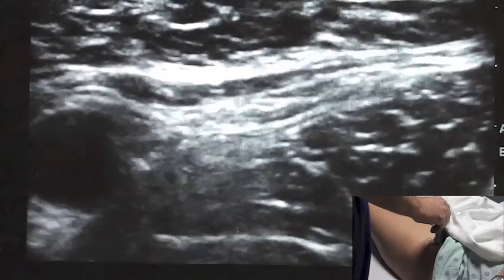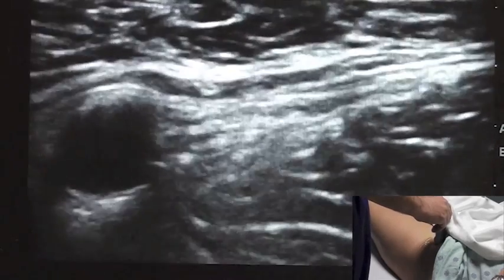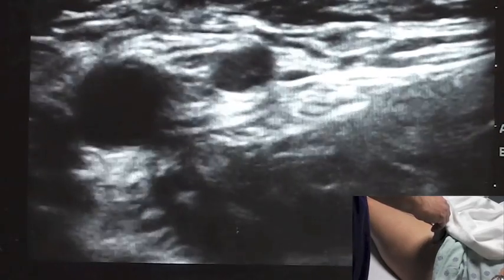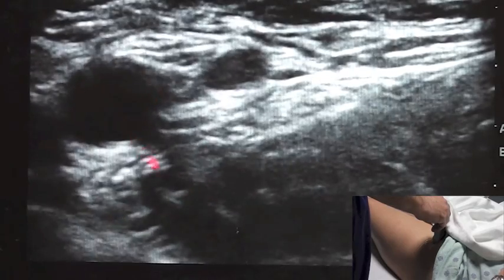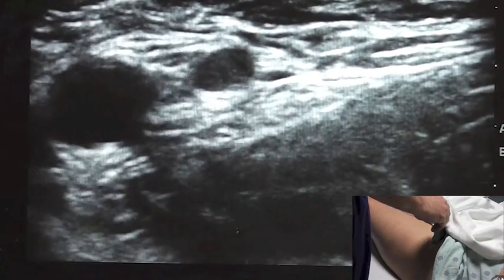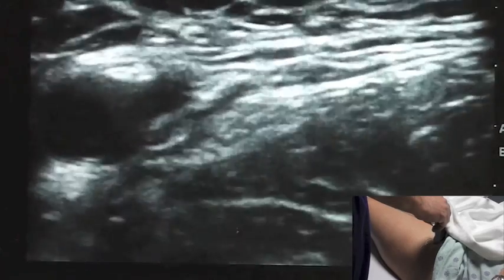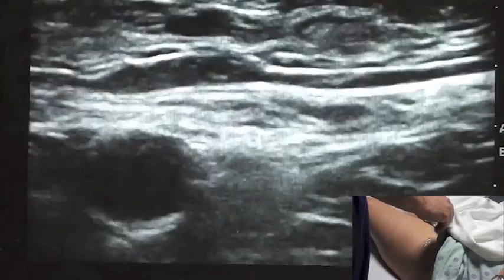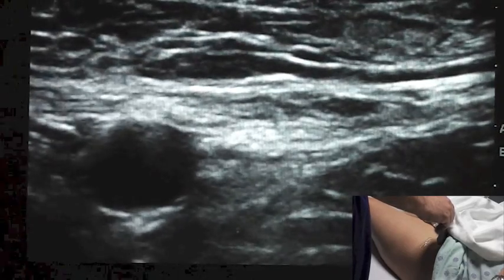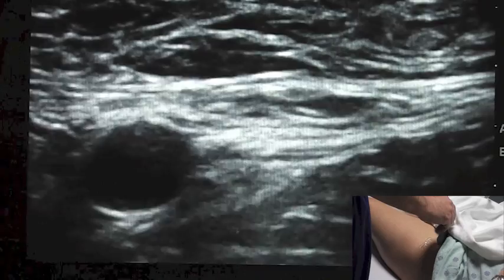Having confirmed that that's a vessel — if my probe is a little bit too caudad, you're going to see it's already given off and split from the femoral artery, and this may very well be the profunda. We don't want to block at this level. I'm going to raise and go cephalad so that I have one clear defined artery here. We know the femoral nerve is going to sit lateral to the femoral artery.